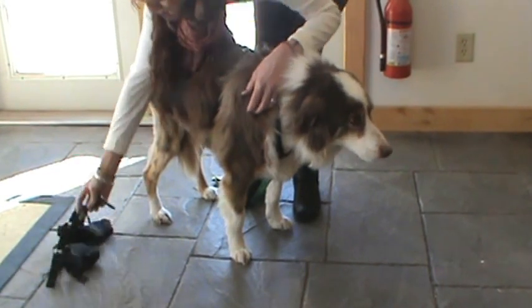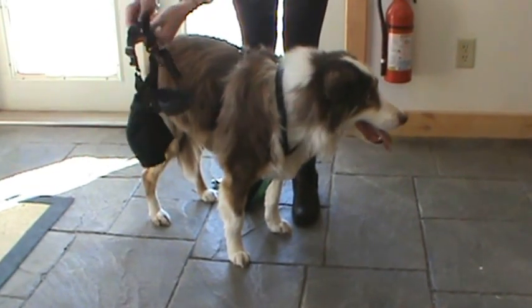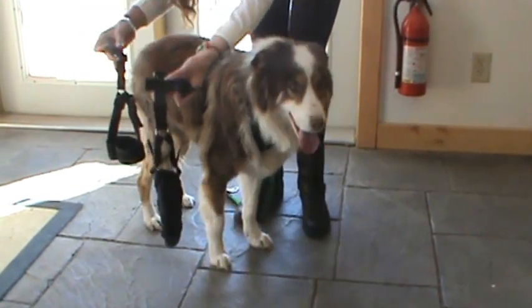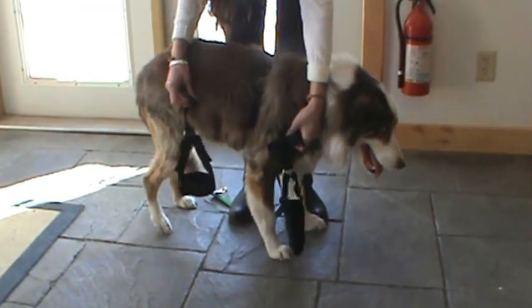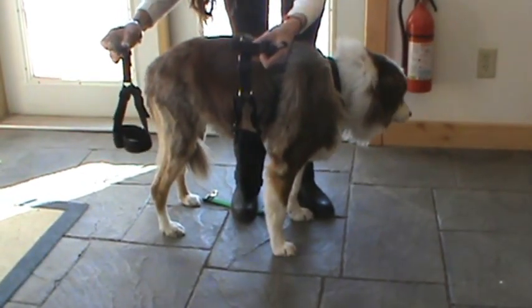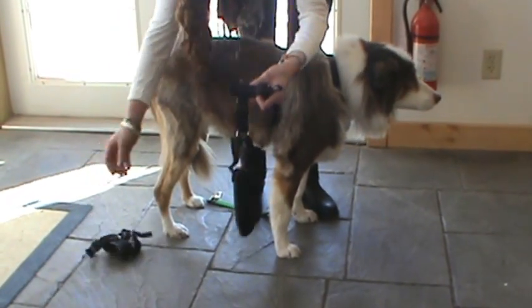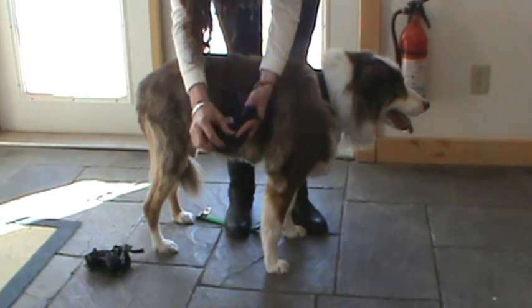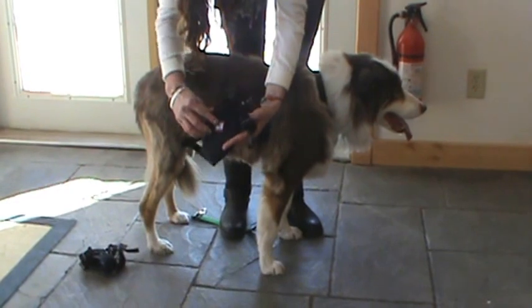Now you take the actual muttony brace and you take the buckle off. You disconnect the buckle so that you've got the sleeve and the cuff. If you have two sleeves, you still just put one sleeve on at a time. So you take the sleeve, un-Velcro the top and remove it. Loosen the Velcro.